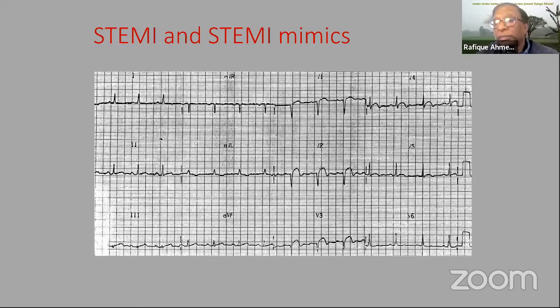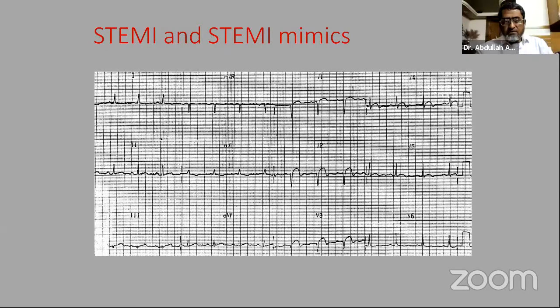Can I make a comment? I opened up two of my patients who had acute chest pain, ongoing chest pain, and having this kind of Q wave. But after opening the artery, on later follow-up after 3 or 6 months, the QRS complex became almost normal, and echo does not show any regional wall motion abnormality.